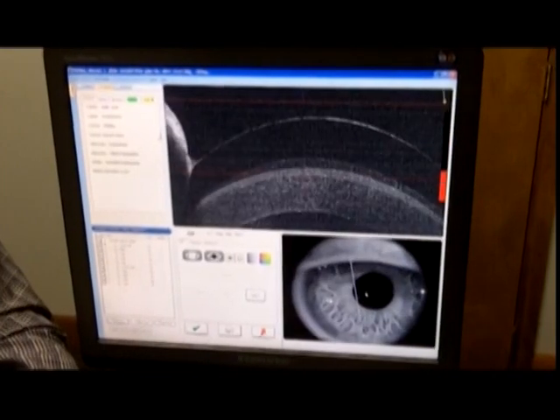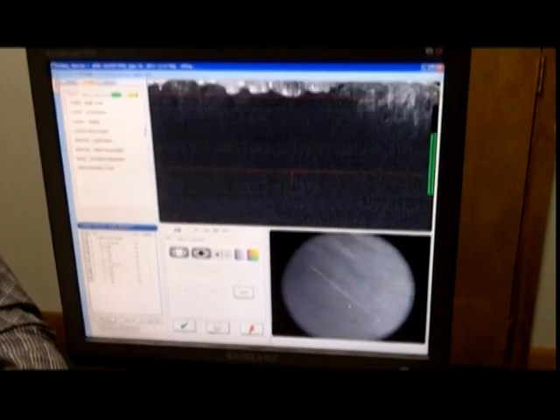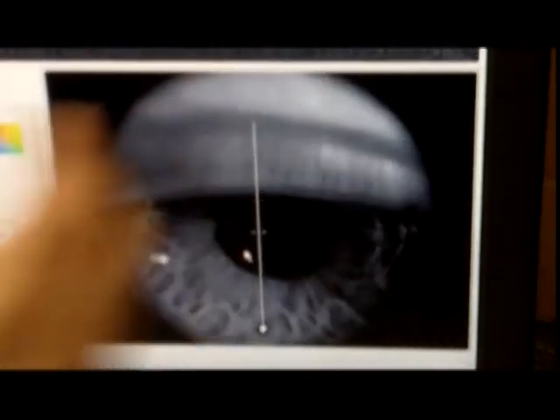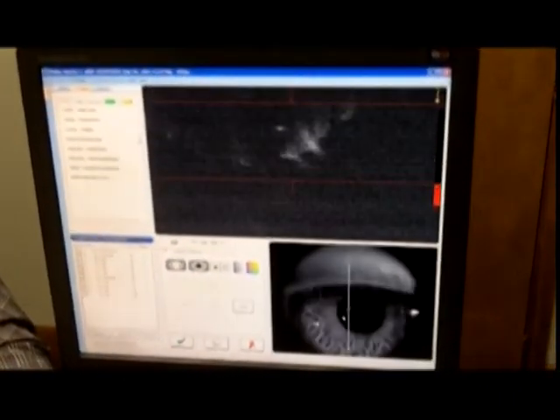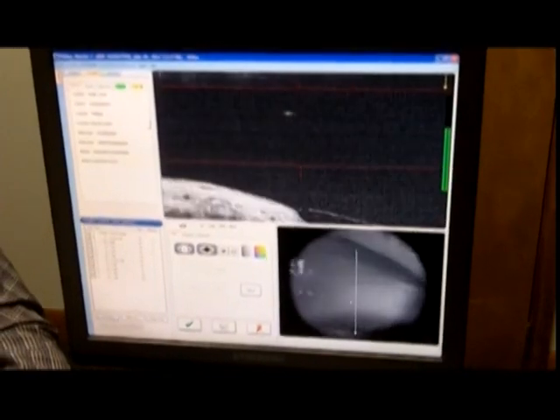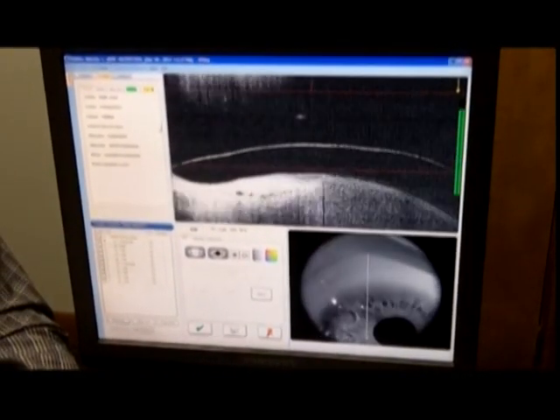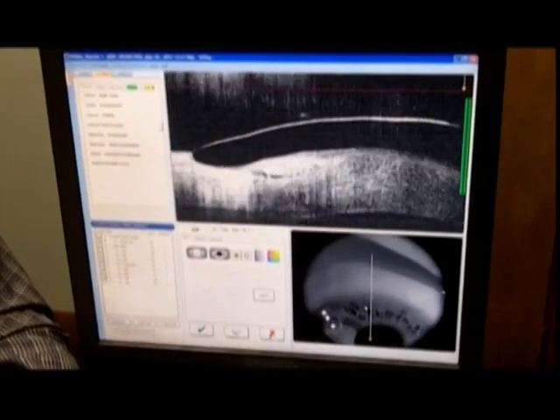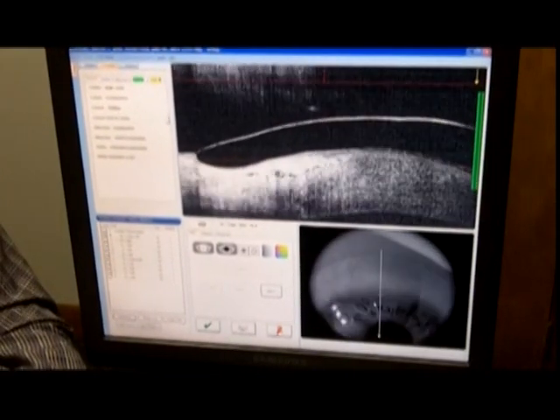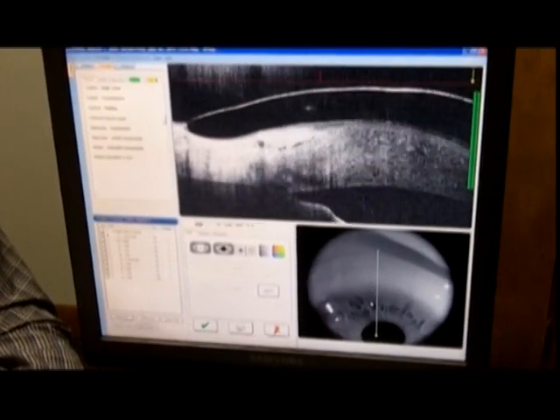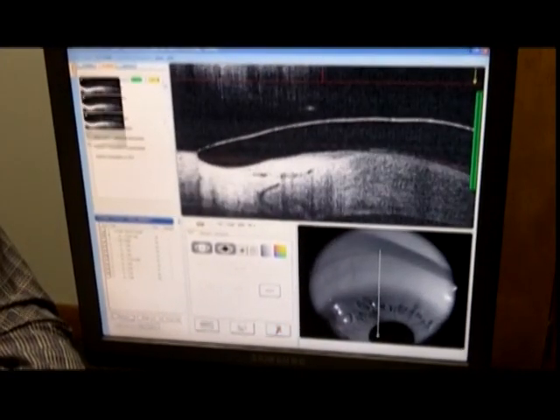We're going to do the top and then the bottom, so I'm going to start with the top of the lens. I'm going to click on the screen — it gives you a horizontal line to start, then you click and use the mouse to scroll and it shifts to a vertical line so we can evaluate the top of the lens. I would stand up here and tell the patient to look down. Now all we see is eyelid, so I'm going to use my finger to get it out of the way. He's looking down too much — look up a little. We want him to look down just enough to get just enough lens and just a tiny bit of sclera so the doctor can see where it's sitting. The image is a little dark so I'm just going to move the lights around.